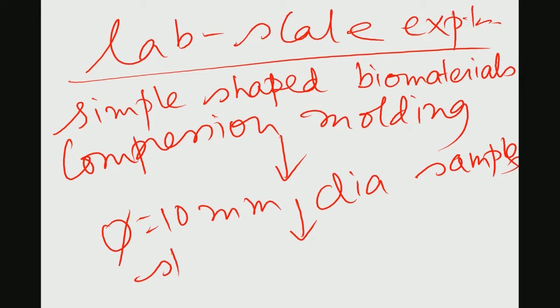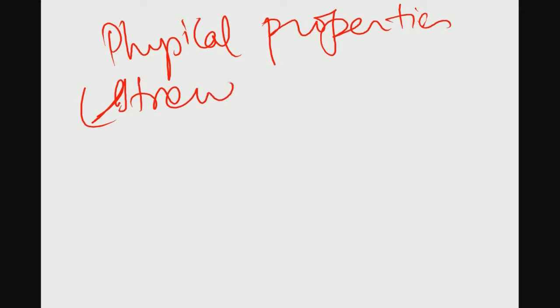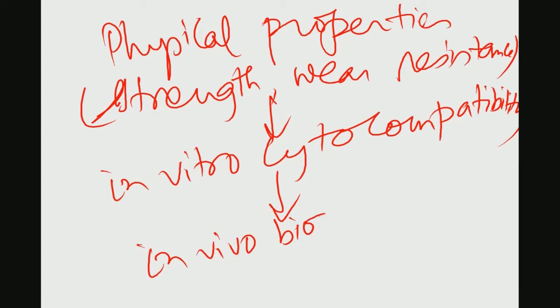and you can do standard tests. The standard tests can be physical property measurements like hardness, strength, wear resistance properties of these materials. Then second, you can do some in vitro cytocompatibility tests, followed by in vivo biocompatibility of selected samples.